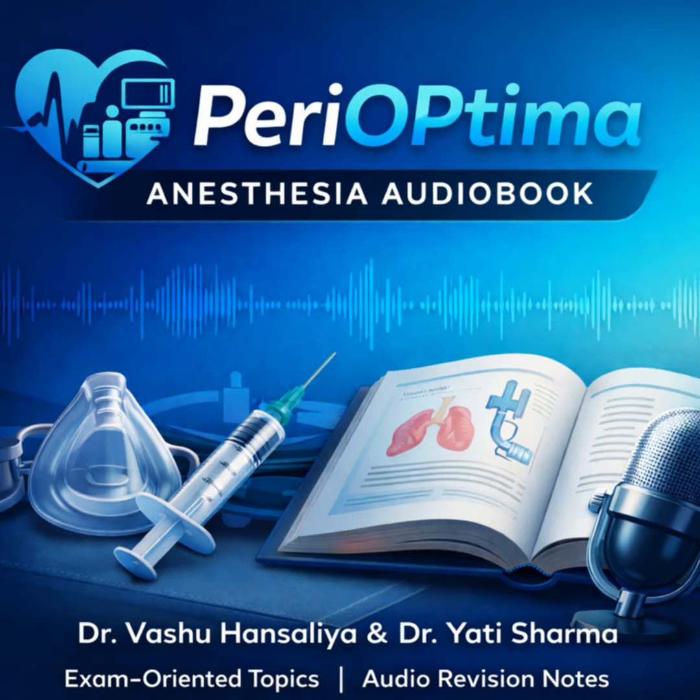And advantage 3. Dose reduction. This is a huge one that Miller emphasizes. With a nerve stimulator, you're just flooding the area, hoping the drug reaches the nerve. With ultrasound, you are precisely painting the nerve. You can reduce the volume of local anesthetic by 40 to 50% in some cases. And that massively lowers the risk of local anesthetic systemic toxicity, or LAST. Exactly. Higher success, fewer complications, lower drug dose.